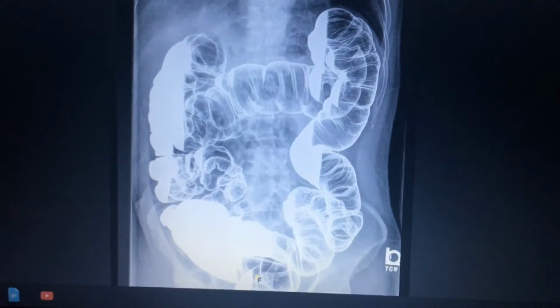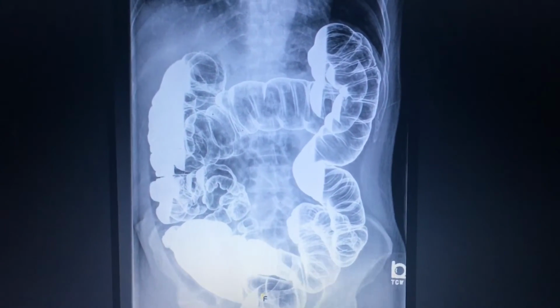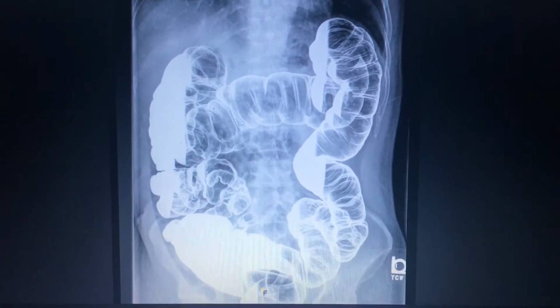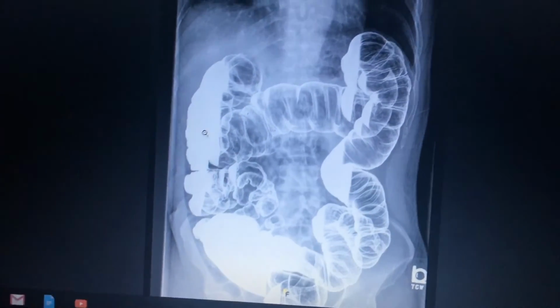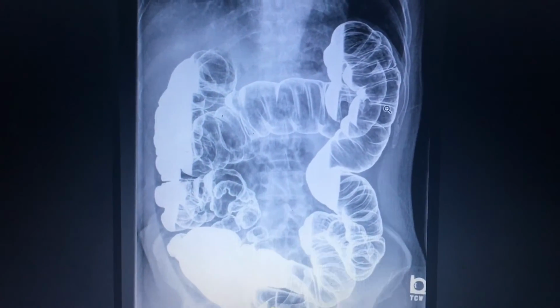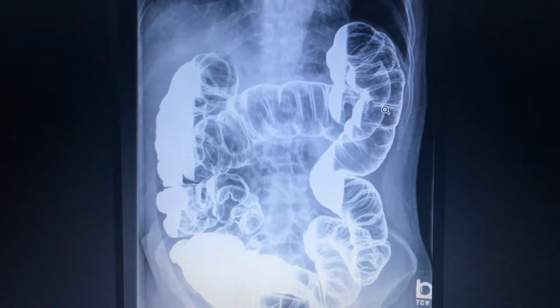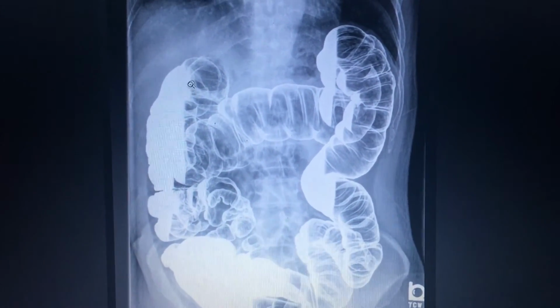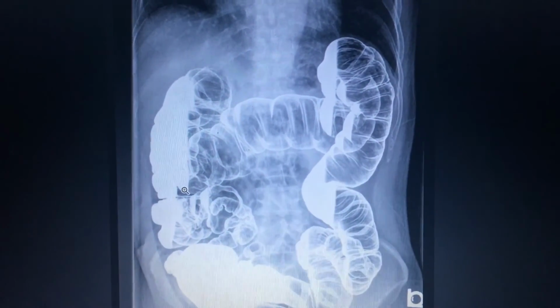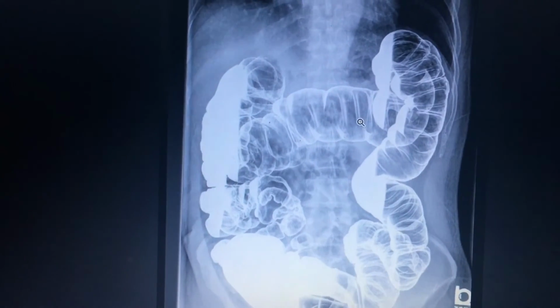This would be the oblique. We got the left side up, meaning that this would be a right decubitus. I'm sorry, I just said oblique, but it's a decube. So right decube. You can see the air flows to the top and the barium settles to the bottom. Left side's up, so this is the left colic flexure. You're going to see the lateral side of the descending colon and the medial lining of the mucosa of the GI tract of the ascending colon. And then right here you have the transverse.